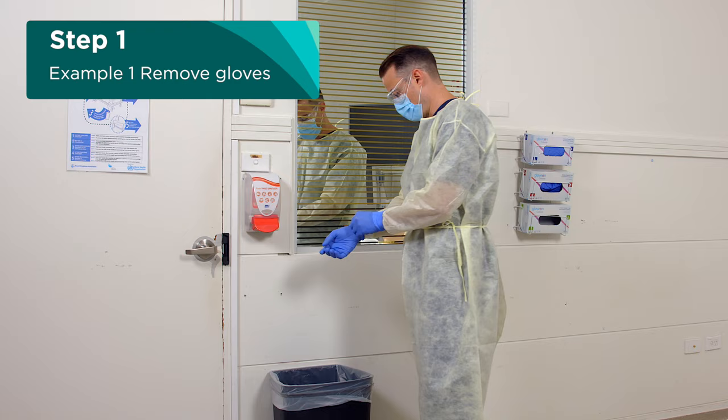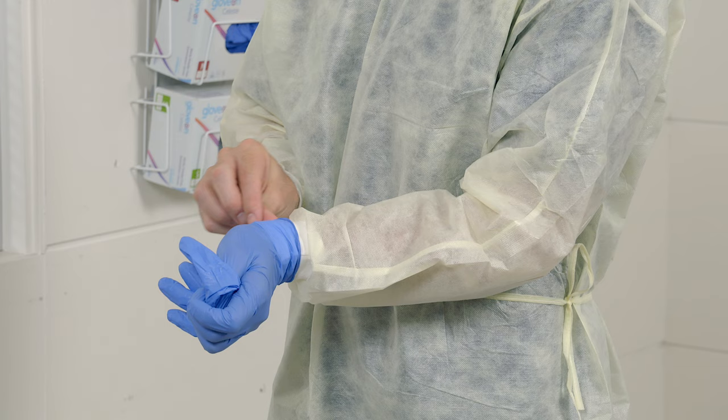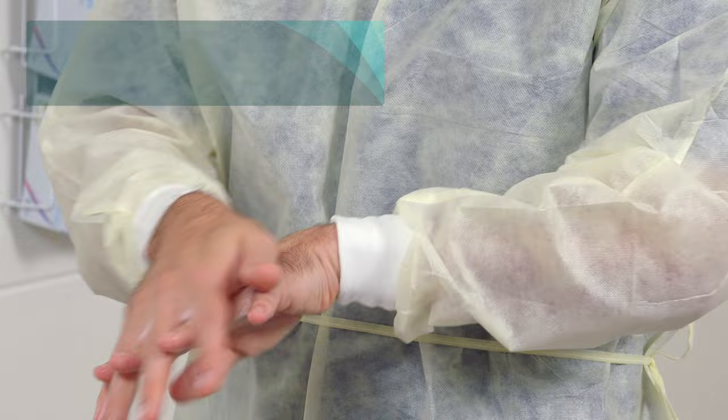The first step is to take off your gloves. Take care to pull off one glove with your other gloved hand by pinching the outside to minimise contaminating your skin, rolling outwards as you remove the glove. Then slip your finger underneath the glove of your other hand and carefully remove and discard into the general waste bin. Then perform hand hygiene.